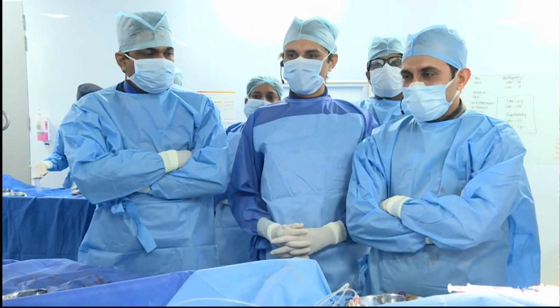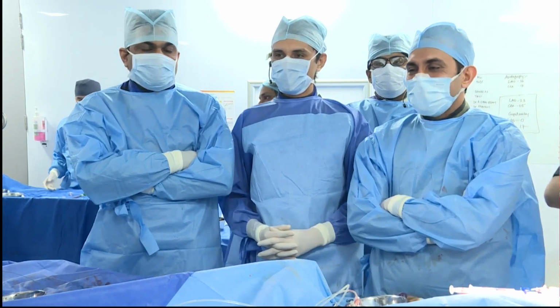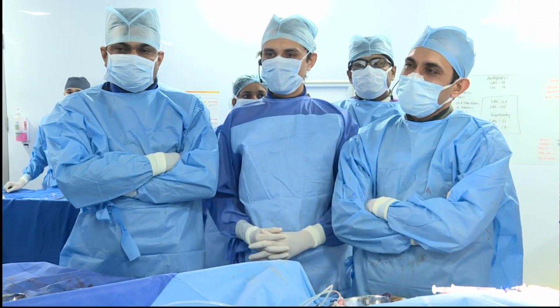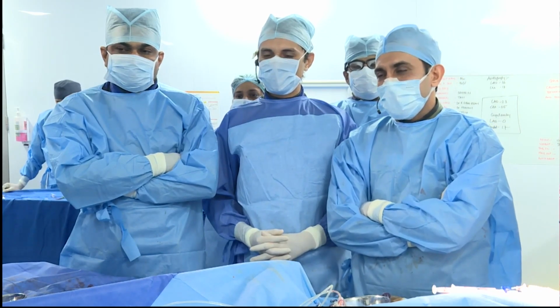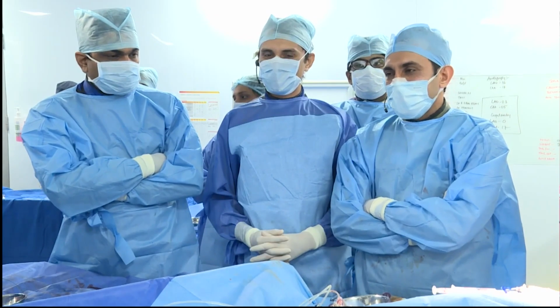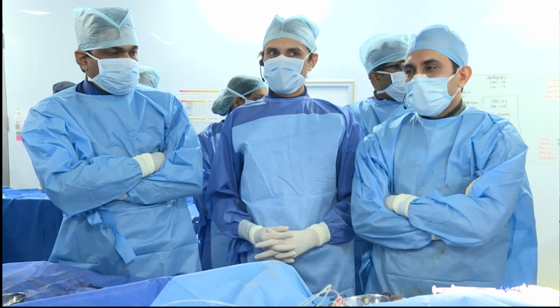I think it's beautifully done, Ravindra. Extraordinary skill. What I really appreciate is the way you approach the patient, because that individual went 5 times to the coronary care unit of the ICU because of heart failure.